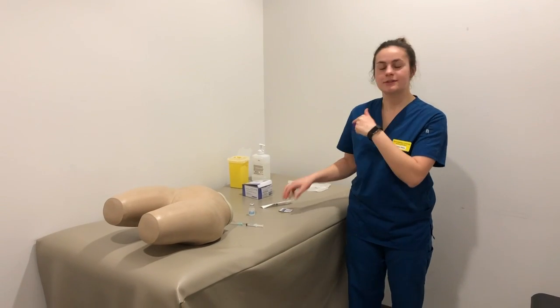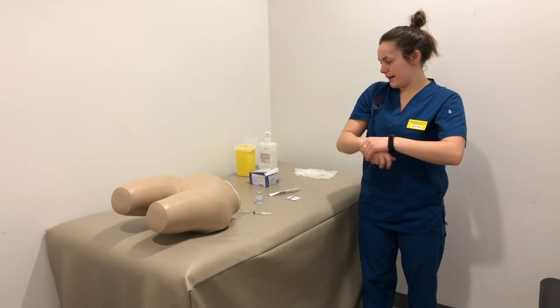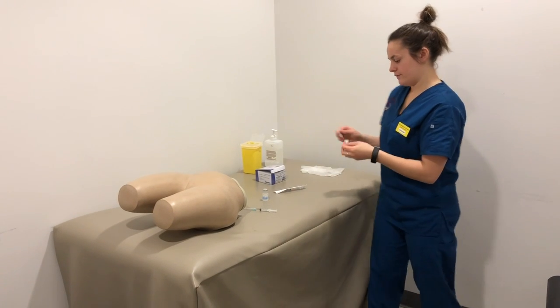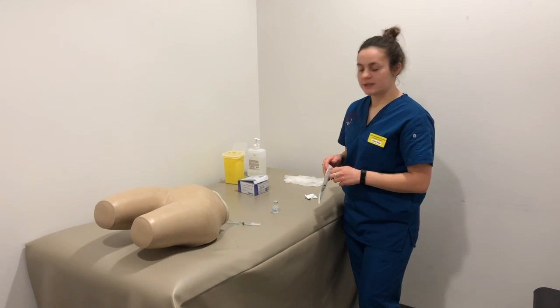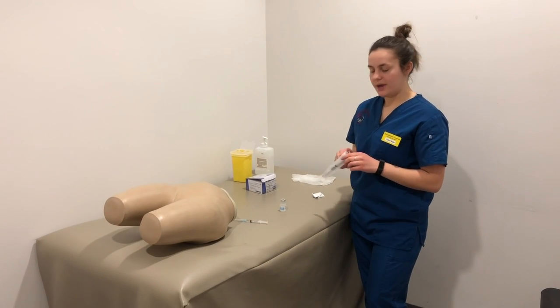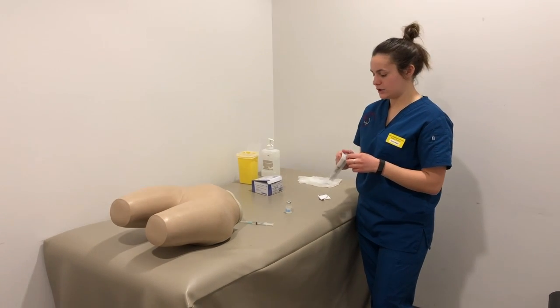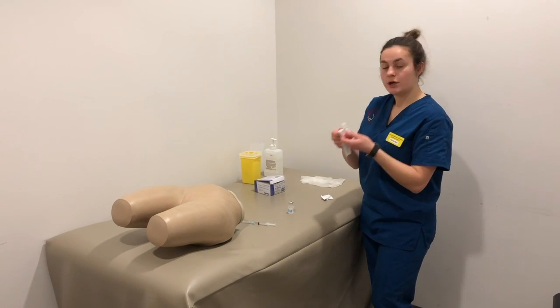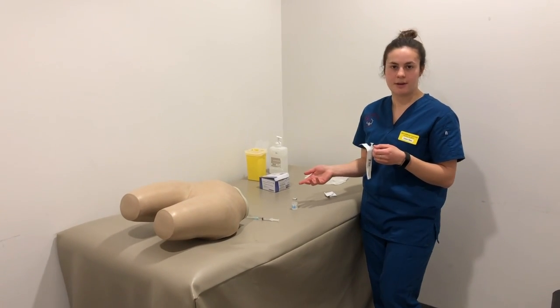Next, I will be preparing for the intramuscular injection. So I'm going to perform a hand hygiene. And again, this is a multi-use vial, so I'm going to clean the vial to ensure aseptic technique. So this is an order for Haldol, which is the antipsychotic medication. What we have in stock is 4 milligrams per 2 milliliter vial. So the calculation for that is we need half a milliliter, 0.5 milliliters. So I have cleaned the vial with an aseptic swab because it is a multi-use vial.